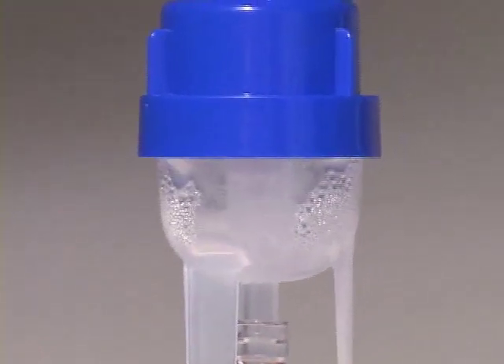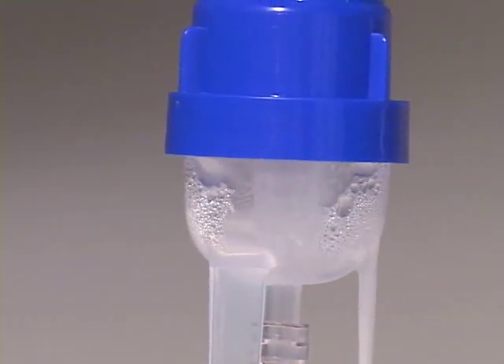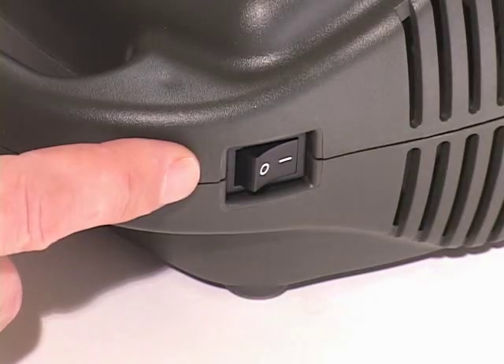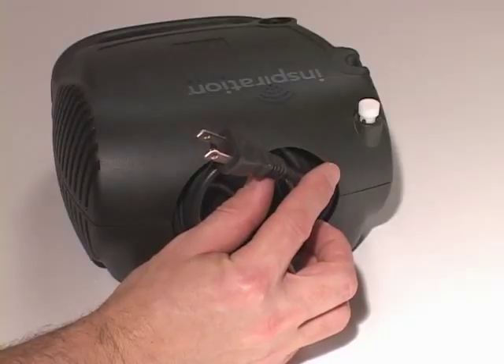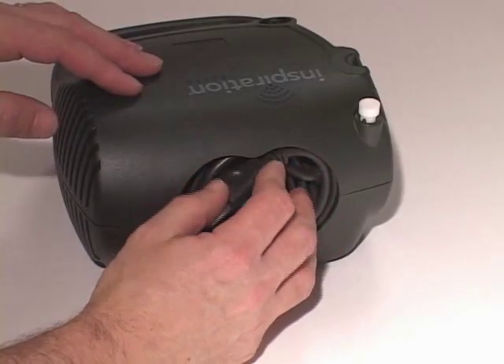It's okay if there are a few drops of medicine still in the cup at the end of your treatment. When you're finished, turn the compressor off. Unplug the power cord and return it to the storage compartment on the back.